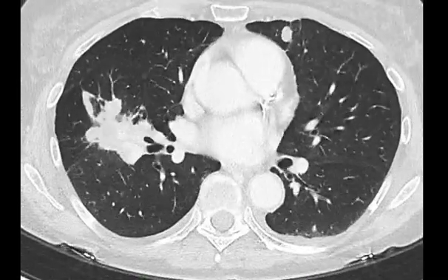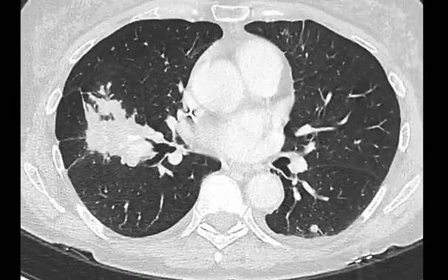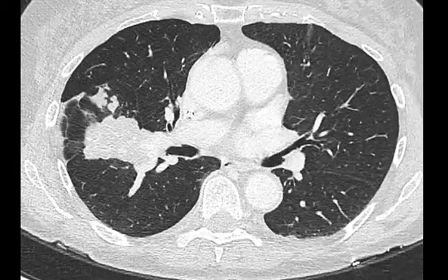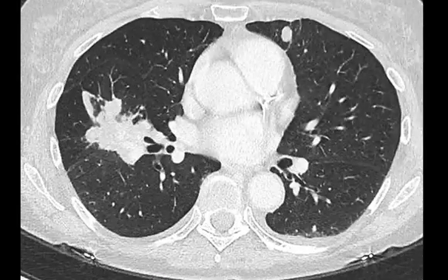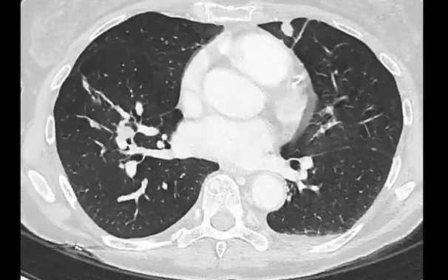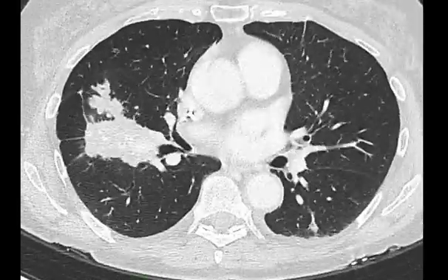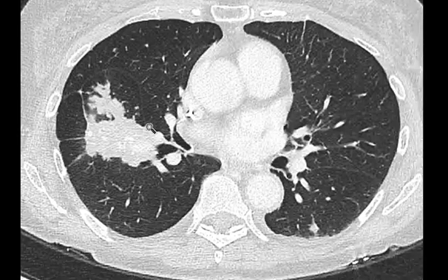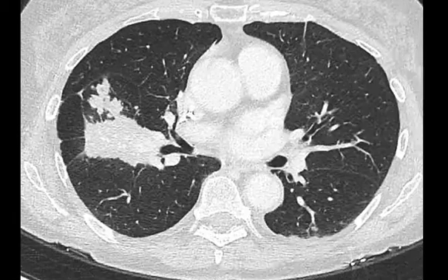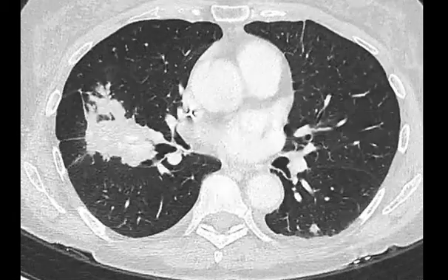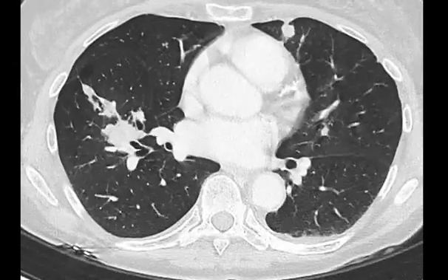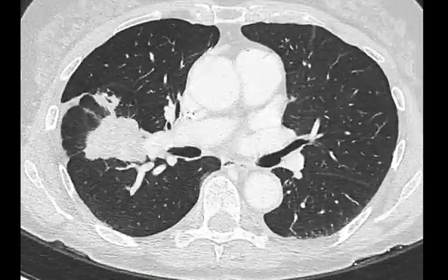The main mass here in the lateral right lower lobe is probably the easiest to target, but the bronchoscope is likely to see to about here, so I suspect there'll be no endobronchial lesion visible. Radial EBUS will be required to help target this lesion.